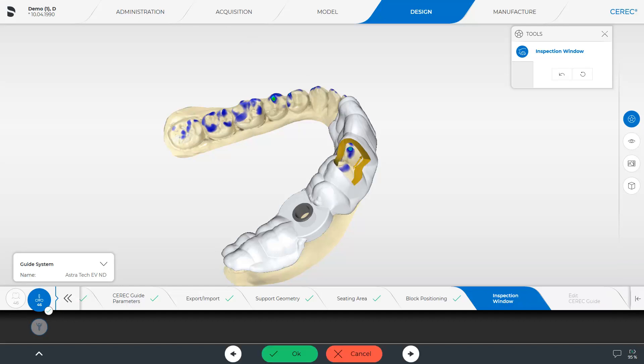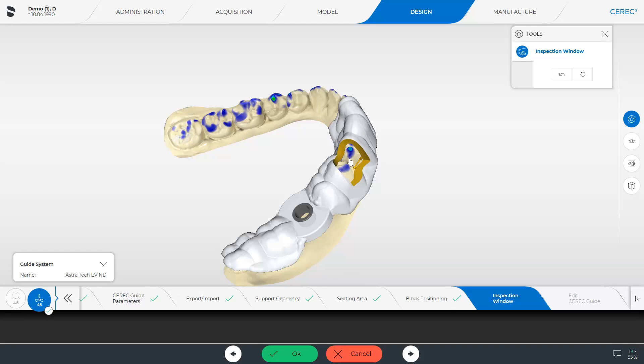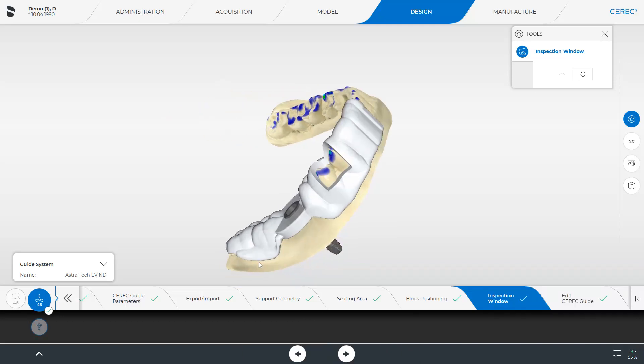Now, an additional yellow arrow pointing in both directions is displayed. With this arrow, the window can be moved. The CEREC software automatically excludes certain areas. Windows can only be positioned where there is enough material. Windows that are open at the bottom are not allowed by the software so as to not impair the stability of the guide. We position the window across two teeth so that we can check the secure guide fit inside the patient's mouth. Then, we confirm with OK and move to the last step in this phase, Edit CEREC Guide.